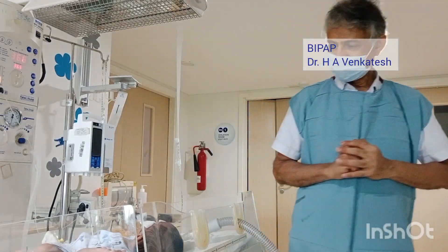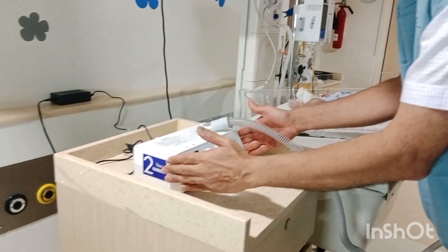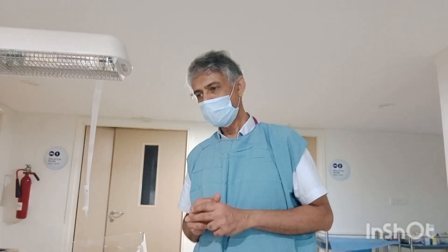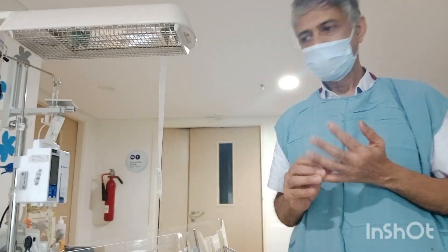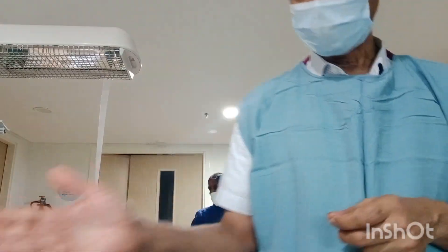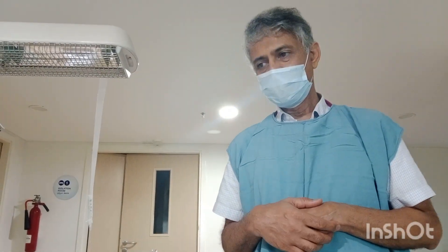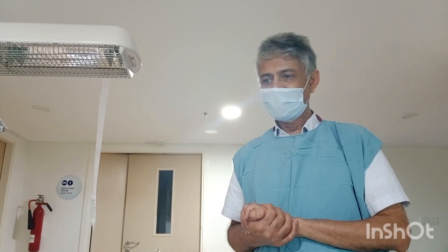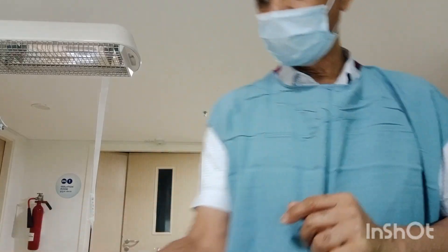Let us learn something about BiPAP machines today. In the newborn intensive care unit, we use multiple non-invasive modes of respiration — normally CPAP, high flow nasal cannula, and BiPAP. During inspiration and expiration on CPAP, the same pressure is delivered. With BiPAP, that changes.